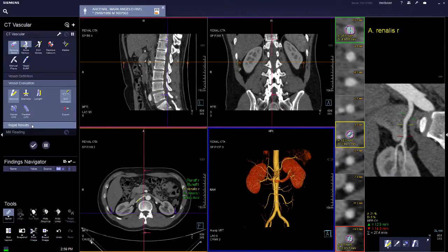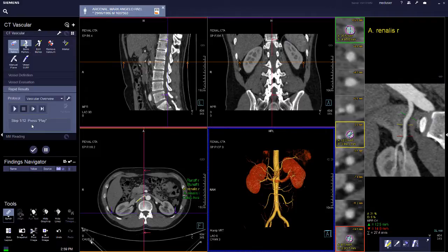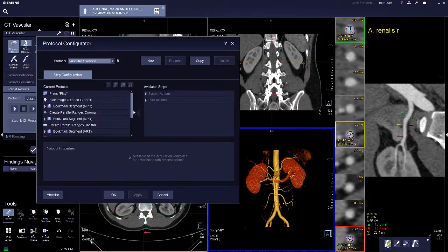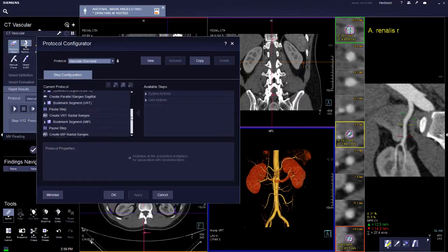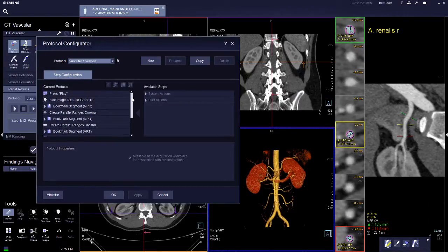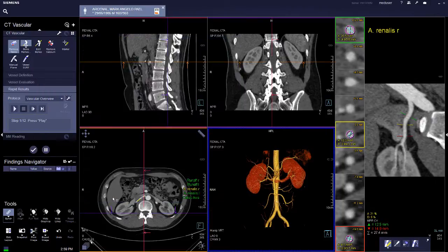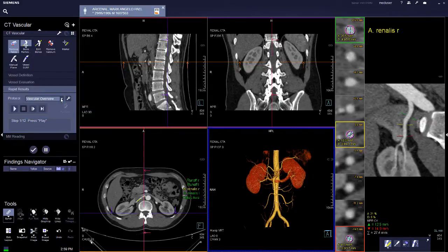For rapid results, you can configure protocols that are standardized so that the workflow can be standardized. For example, this is a vascular overview protocol — you can press play.